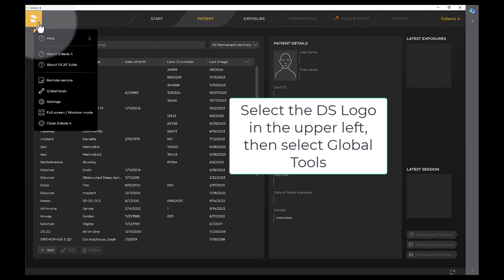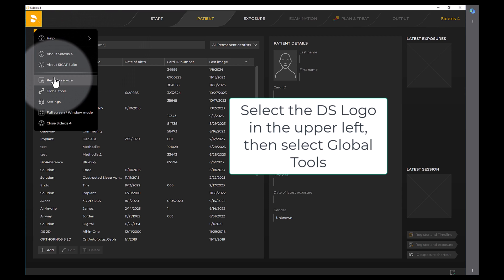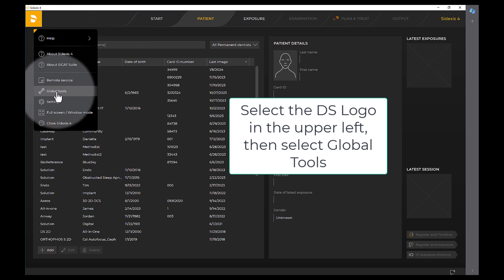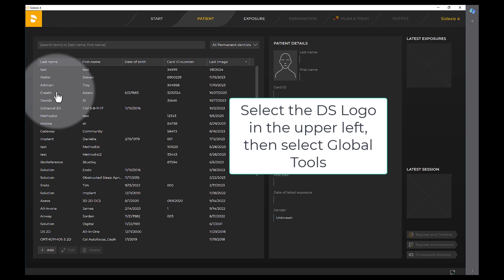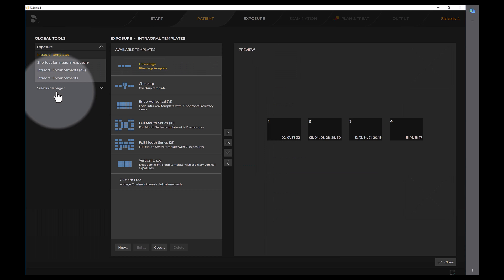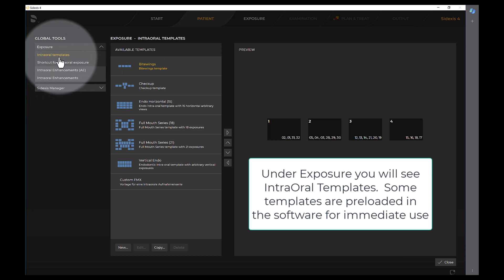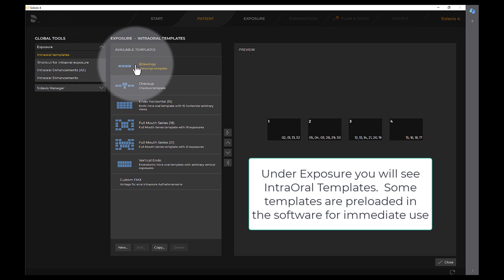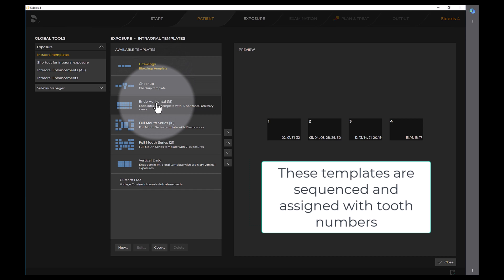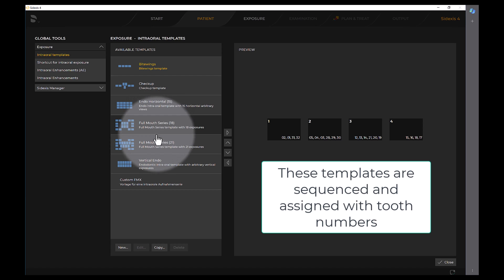Select the DS logo in the upper left, then select Global Tools. Under Exposure you will see some intraoral templates. Some templates are preloaded in the software for immediate use. These templates are sequenced and assigned with tooth numbers.